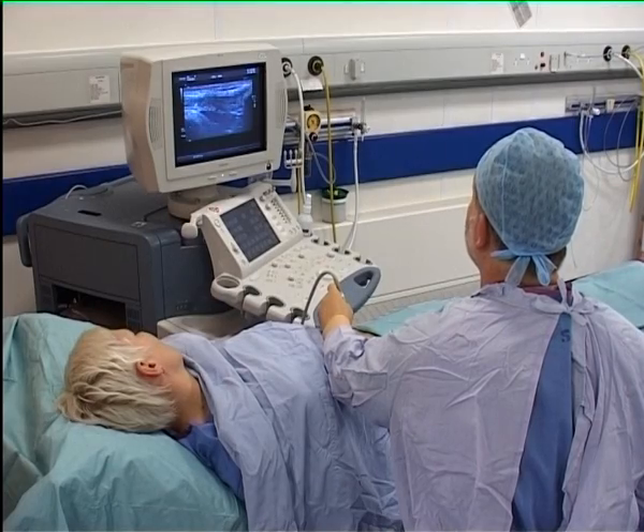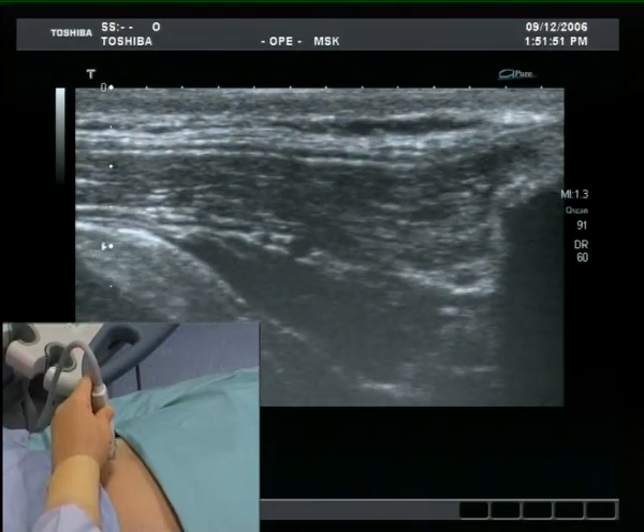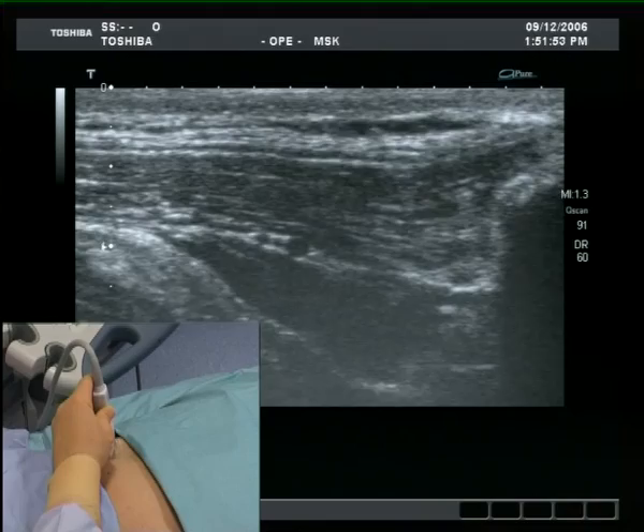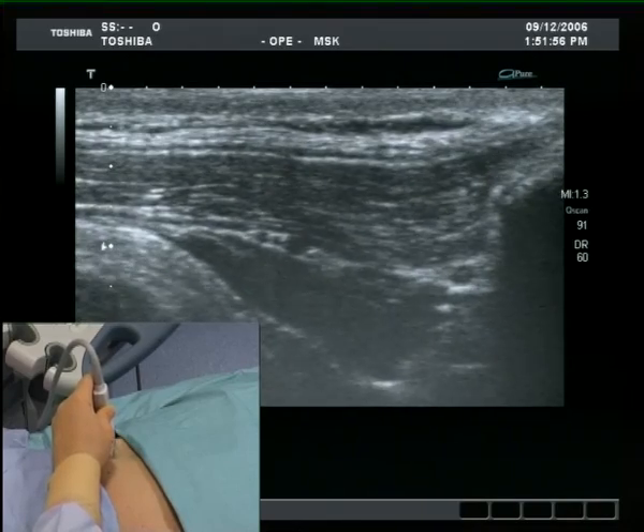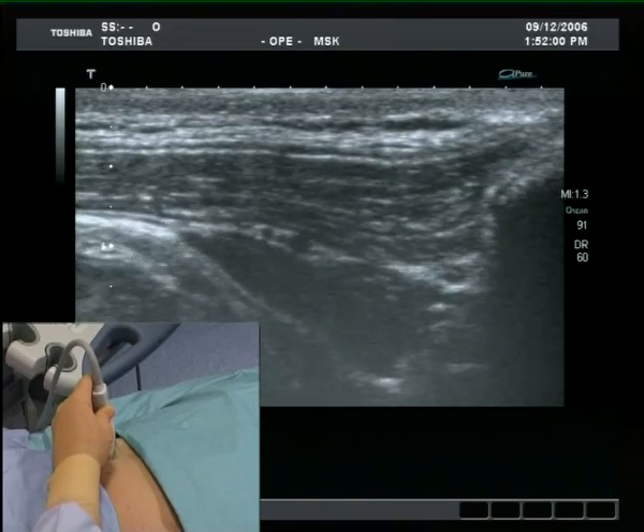The probe lies just on the iliac crest on a line between the anterior superior iliac spine and the umbilicus. The internal landmarks are the bony outline of the crest laterally and the layers of the abdominal wall muscles.